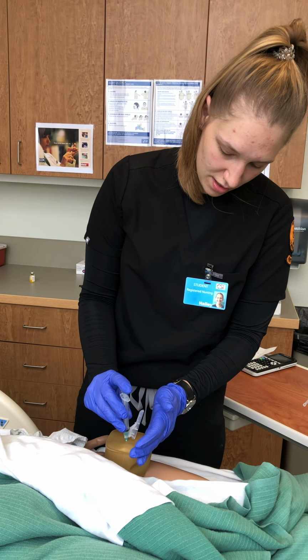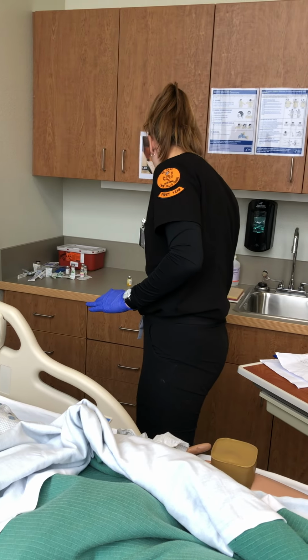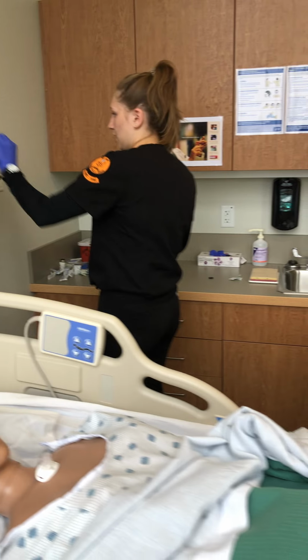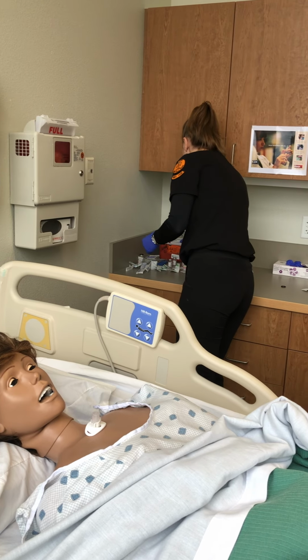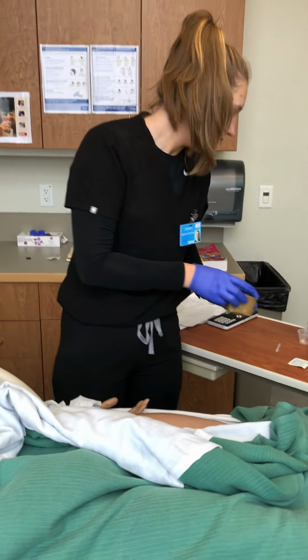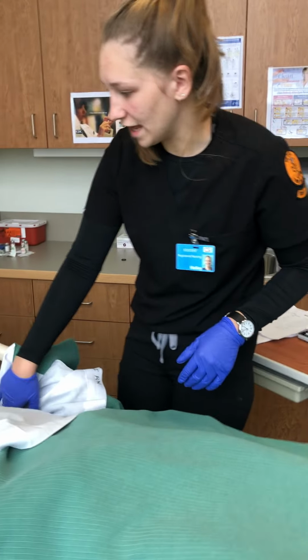I'm going to pull it out, and I'd have a cotton swab that I'd put over that and a Band-Aid. I'm going to close the safety cap on it. That should not be sticking out like that. And I'm going to go ahead and dispose of this in the sharps container. I make sure to cover that with the Band-Aid for you. Okay, great job. So now we're going to move on to your next medication.